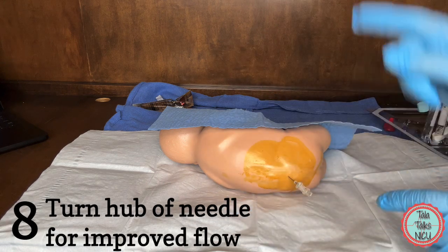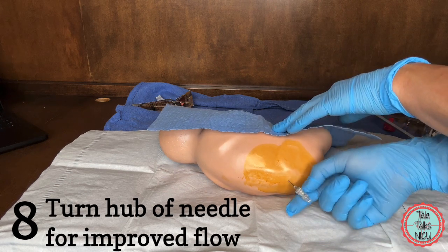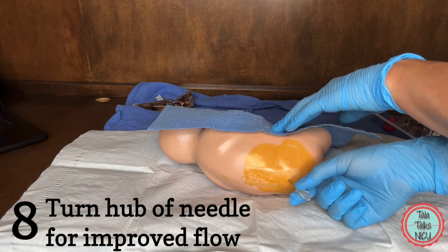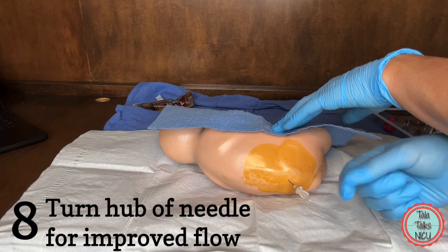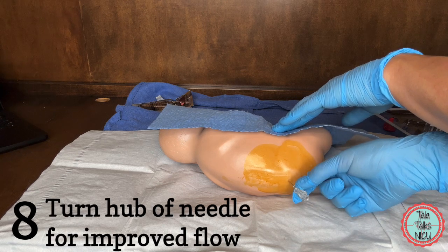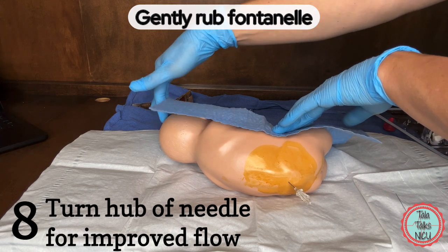Eight: you feel like you're in the right place but the CSF isn't flowing. Slowly turn the needle around in a circle. Maybe the bevel was pointing in the wrong direction or it was up against some of the spinal roots. Sometimes that's enough to get it flowing. Sometimes gently rubbing on the fontanelle as well can help.